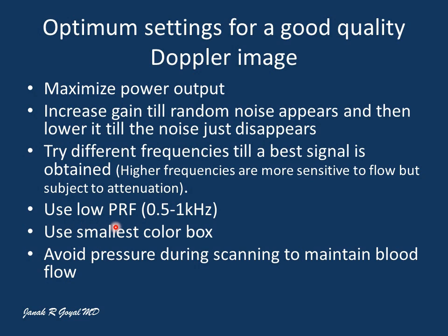Use low PRF between half and 1 kilohertz. Use smallest possible color box to include your region of interest. Avoid pressure during scanning to maintain blood flow.